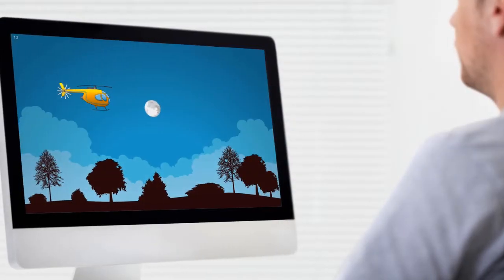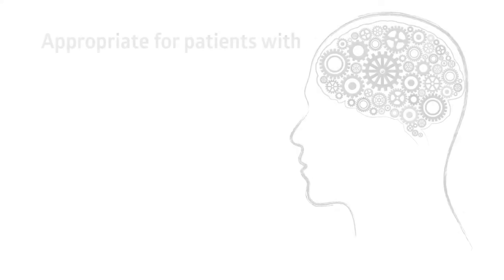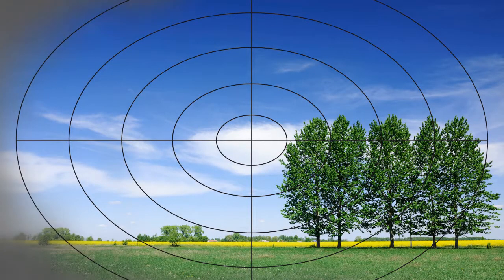The RehaCom module Saccadic Training trains rapid jumping eye movements. It is appropriate for patients with visual field impairments or visual neglect. Training the saccade increases the visual search area. The visual field impairment can be partly compensated.